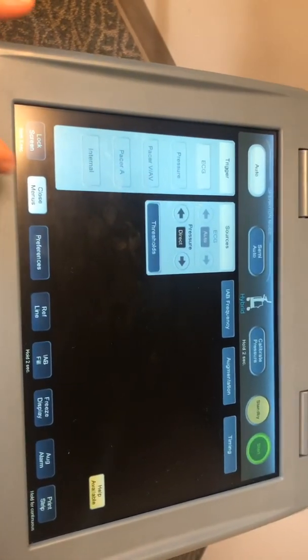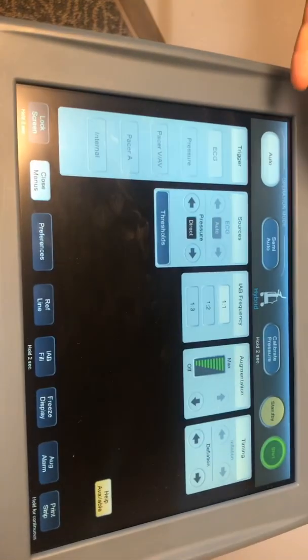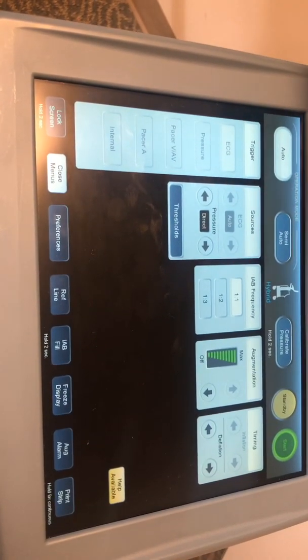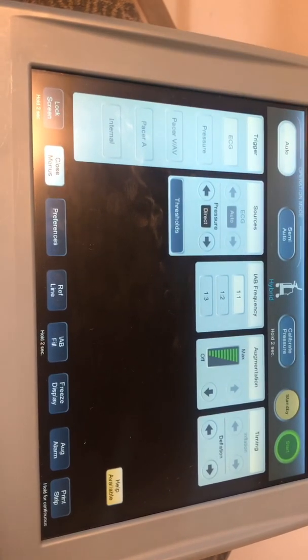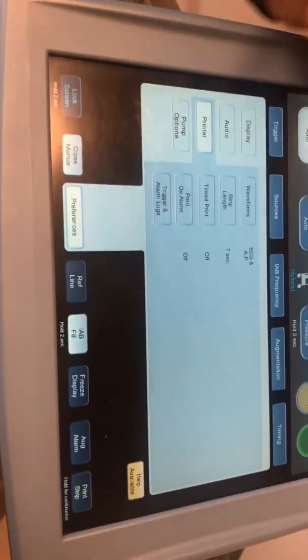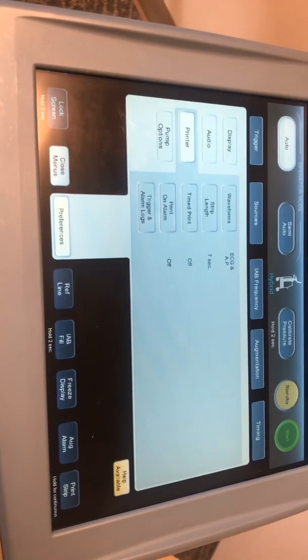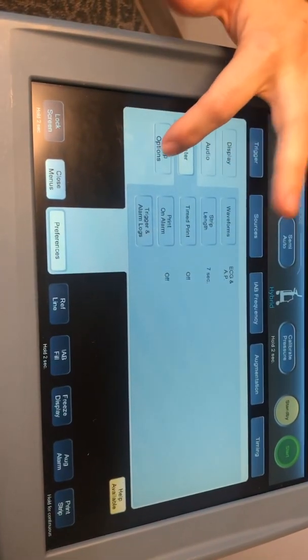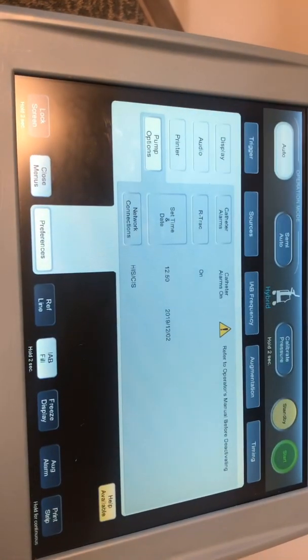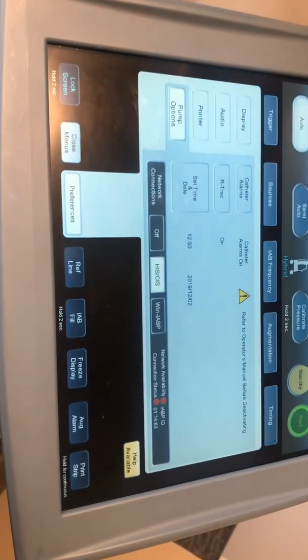You can go through and pick each trigger source, or you can hit open menu and it'll pull them all up so it looks very similar to the balloon pump we're used to. You've got trigger sources, balloon pump frequency, augmentation, and timing. Over here you've got your preferences — you can go into printer if you wanted it to do a timed print every four hours or whatever your unit requires.